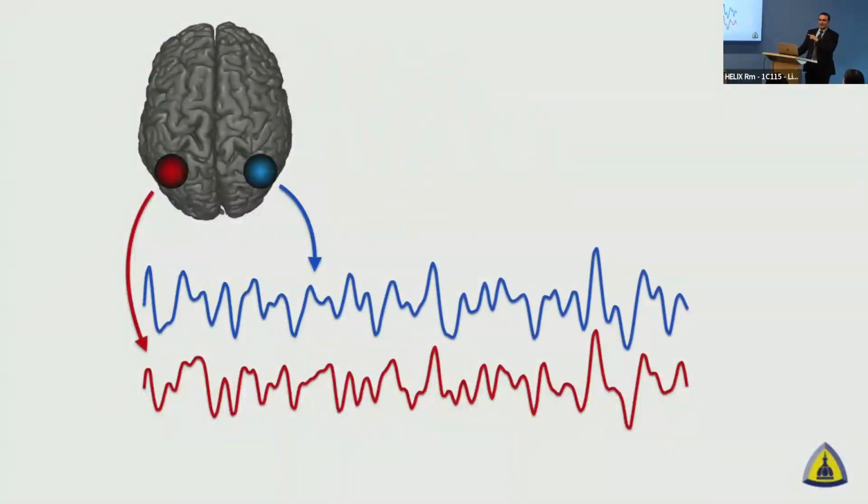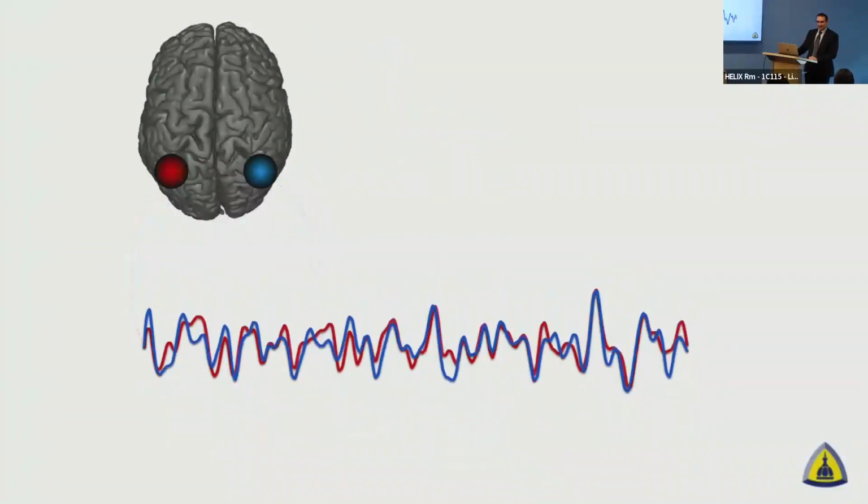Okay, so now that looks funny, right? Because when the patient was not doing anything and the waveform looked completely random, for some reason, the left side of the brain and the right side of the brain in the same kind of opposite location have pretty much the exact waveform. So that means that there's some kind of communication going on between those two parts of the brain. Otherwise, this is not something that would happen by chance.